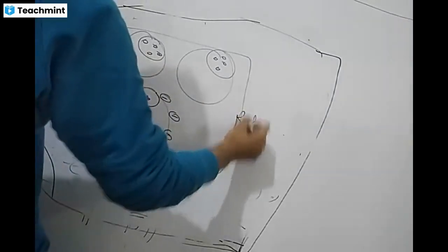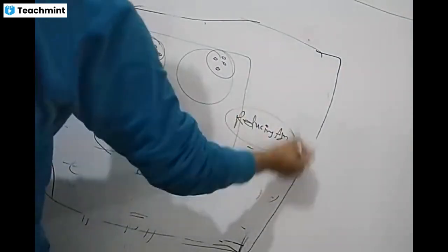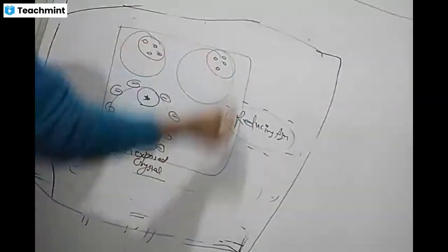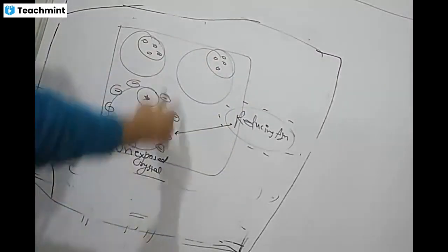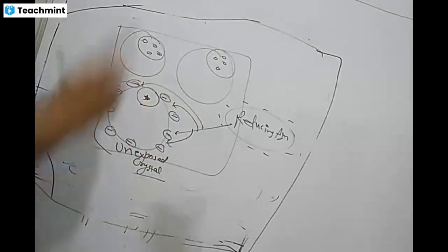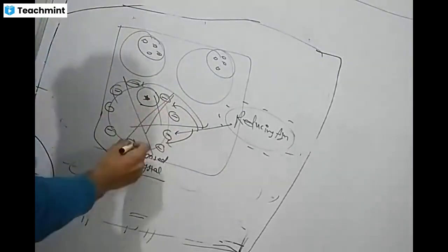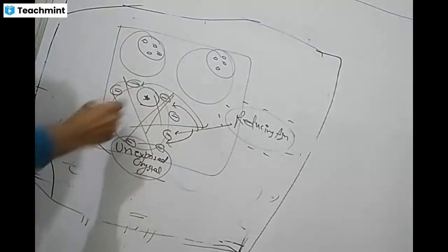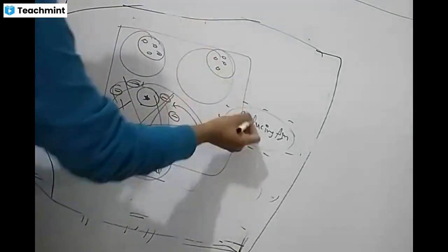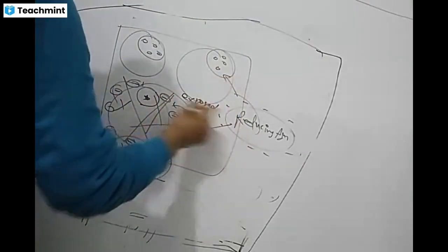So our developer, which has a reducing agent with negative charges, when it comes to the emulsion, will get repulsion from the whole surface. It means the reducing agent will not enter the non-exposed crystal, so it will not reduce this one. So the reducing agent only enters the exposed crystal.